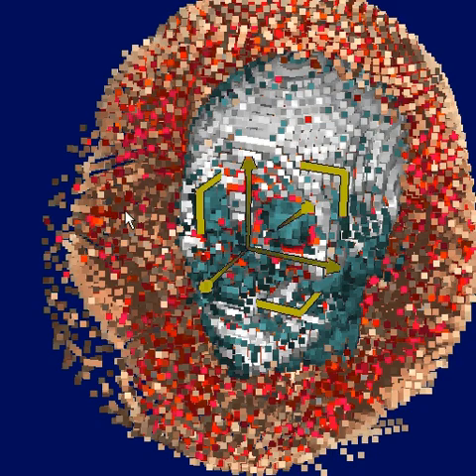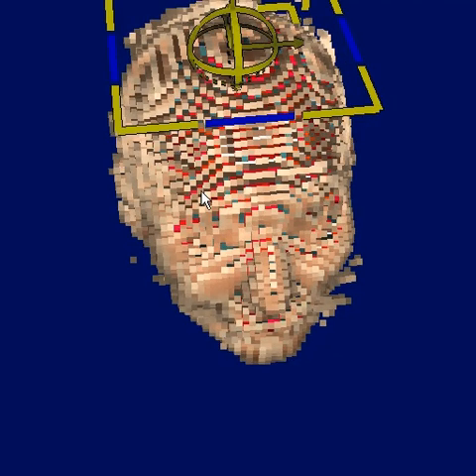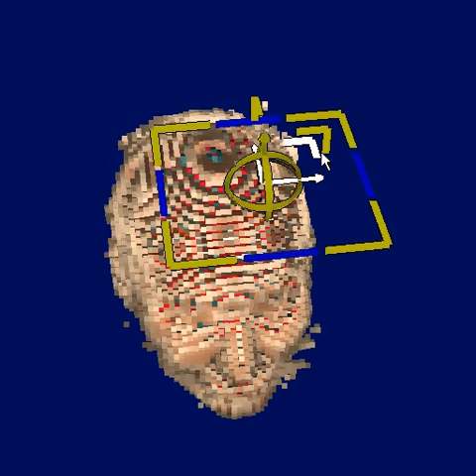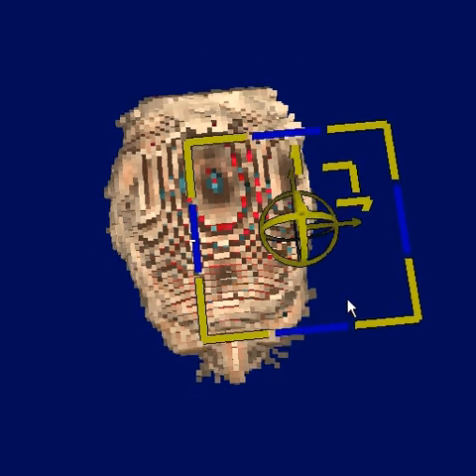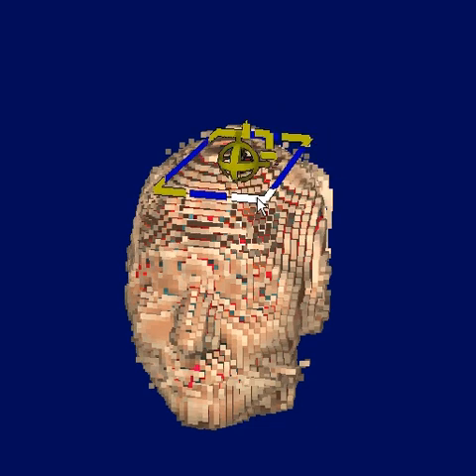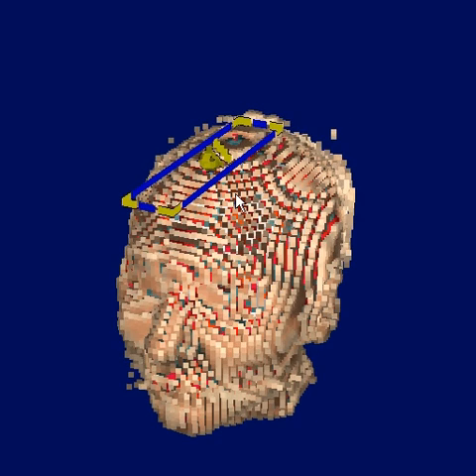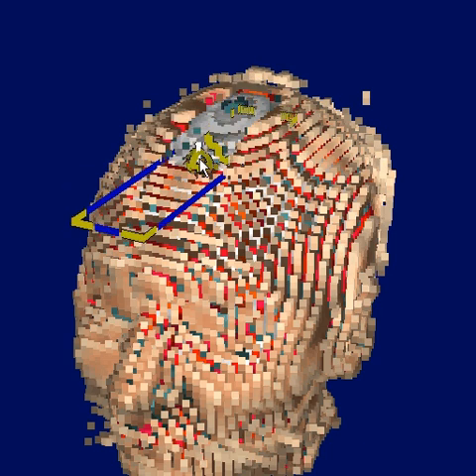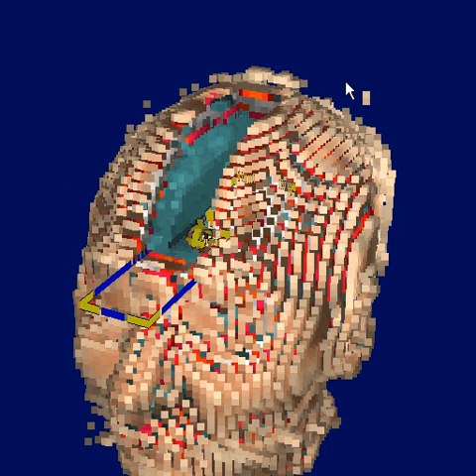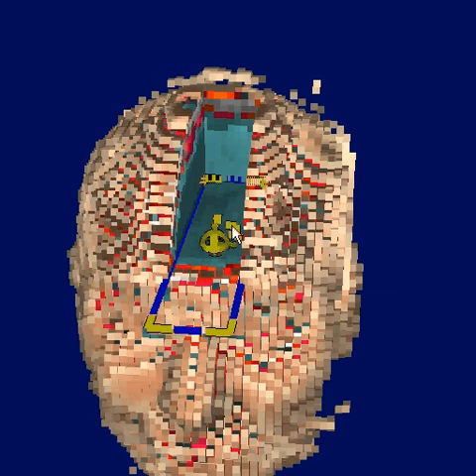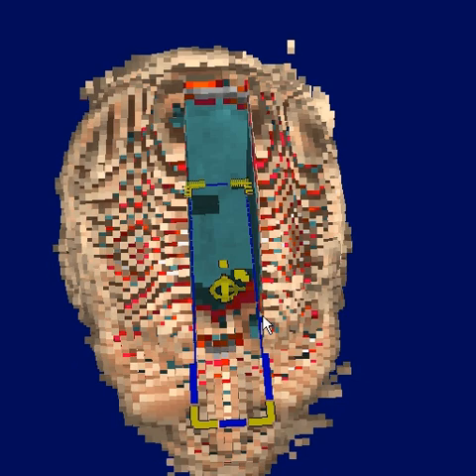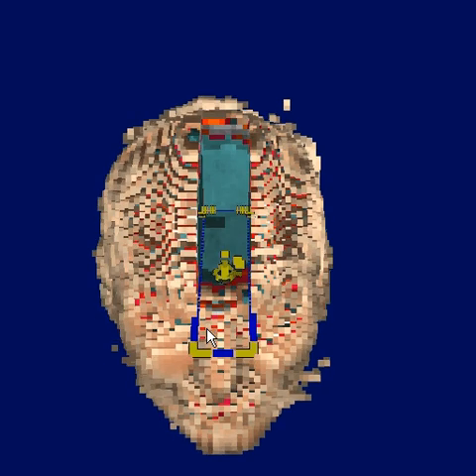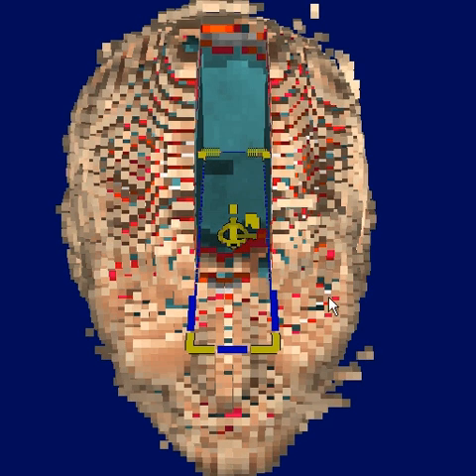The next tool is the box spreader. This quadrilateral is the base of a box that extends upward. We can make this box very thin and then push it into the volume. Let's select all layers again. What this box does is it evacuates all the voxels within it by pushing them to the side.